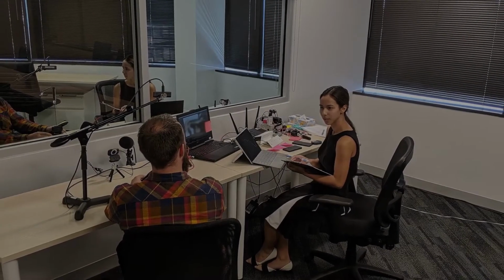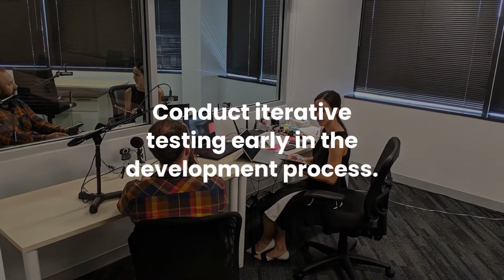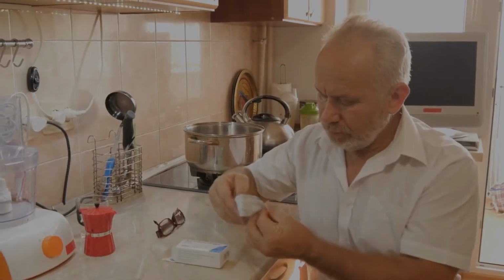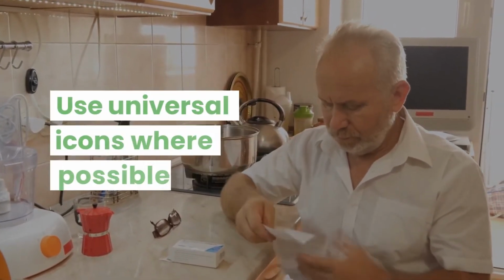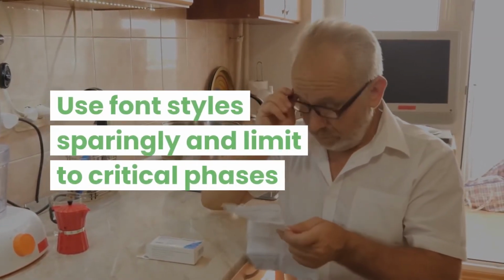Testing can inform layout, design, and language of packaging. It is recommended to conduct this testing early in the development process. Users don't look at instructions unless they are well designed. Use pictures to illustrate critical information. Use universal icons like stop signs where possible, and use font styles sparingly.